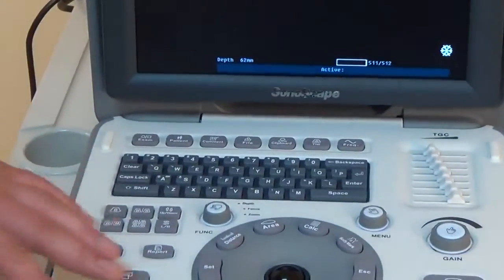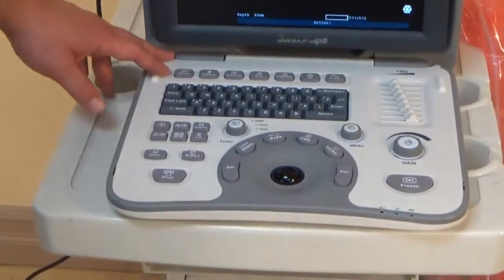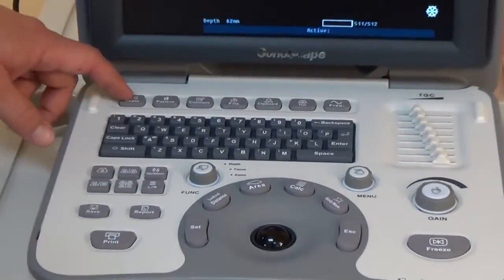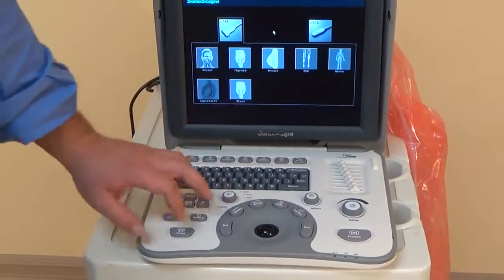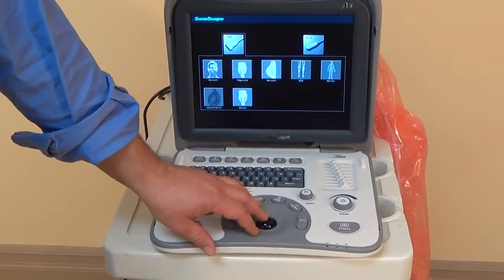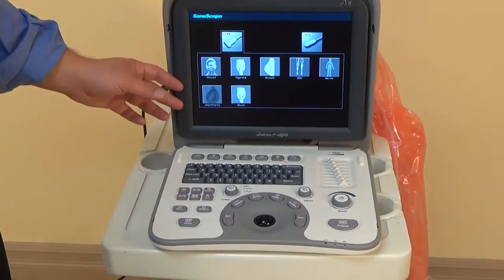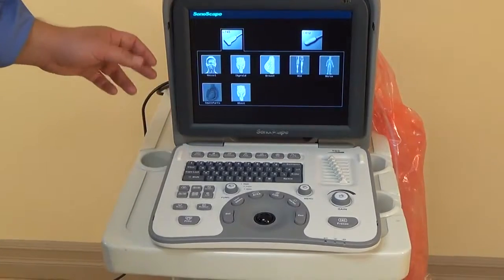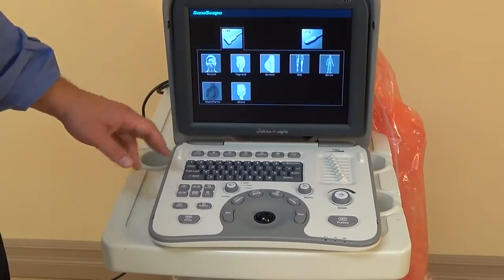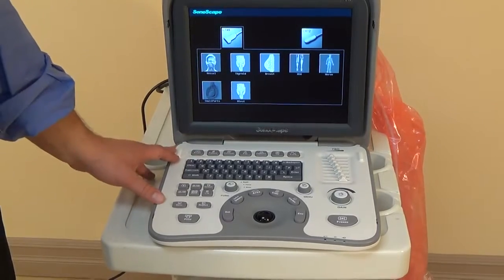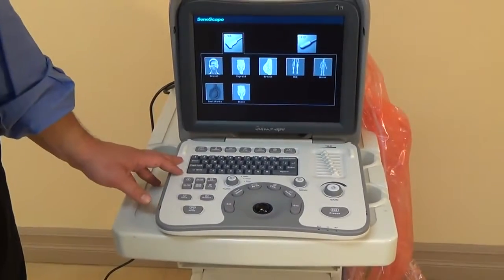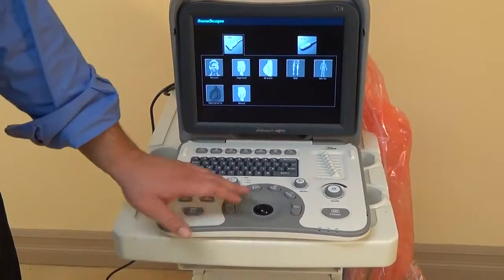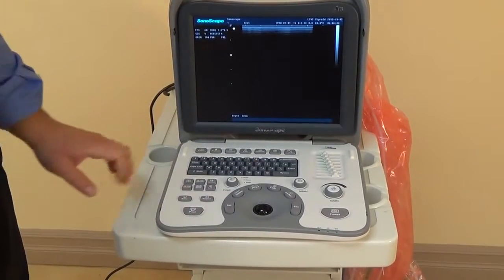So just to start off, your basic functions are pretty laid out for the average user. Up here we have an exam setting, so you press that, depending on which probe you have selected, you can pick what type of exam you're doing. This specific model right now has human software available, so we'll just select any random one, and then it comes up.